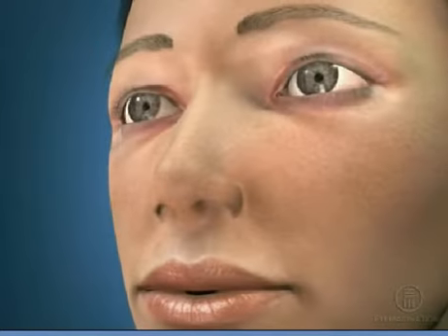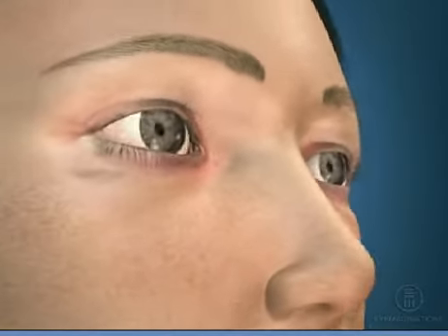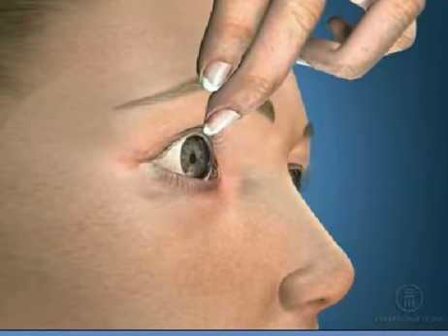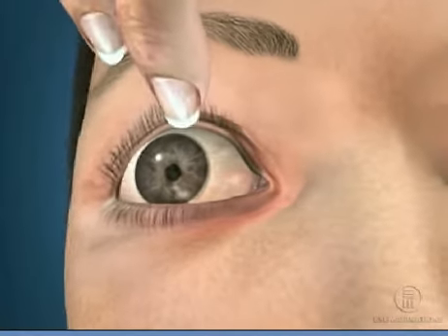When applying your contact lens, the first step is to use the middle finger of your non-inserting hand to pull and hold your upper lid at the lid margin. This keeps your eye from closing. The lid margin is the edge of your eyelid where your eyelashes are located.